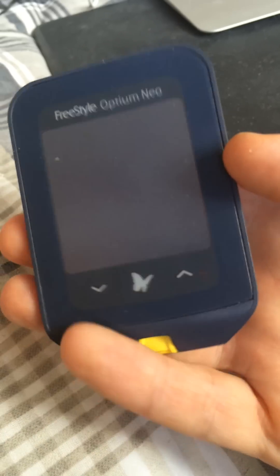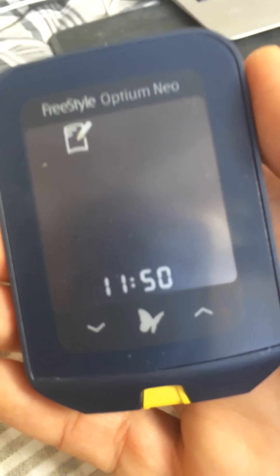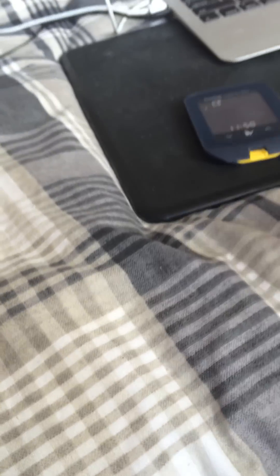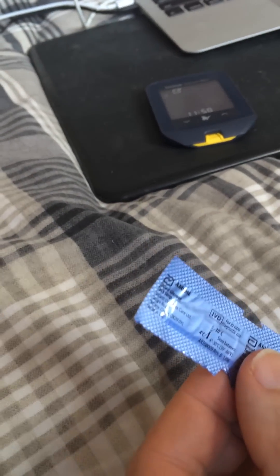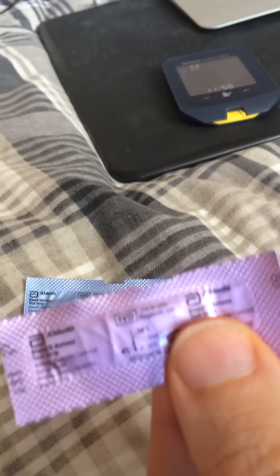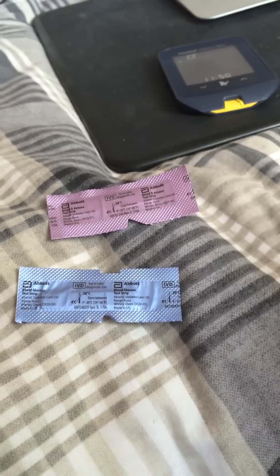It's very simple to use. First of all, you just press on and it comes on, and then we've got to put our strips in — testing strips. This is the glucose testing strip, so there's one for each. The other one — this is the blue glucose one, and this is the purple one, my favorite color, which is for the ketones.